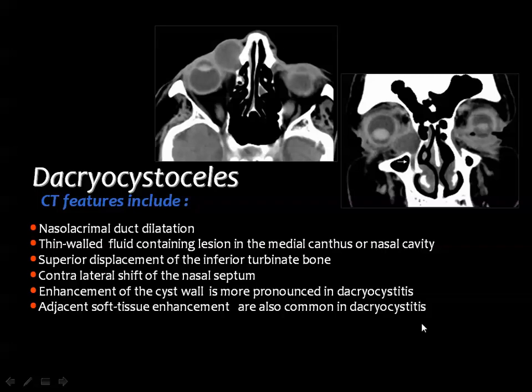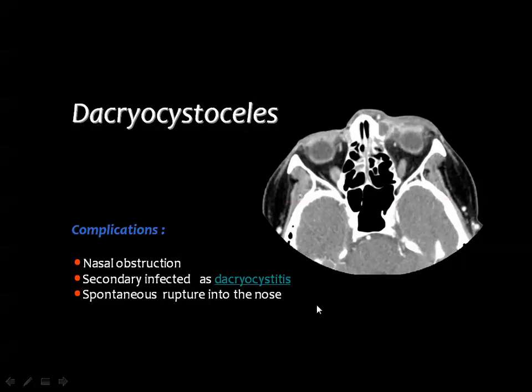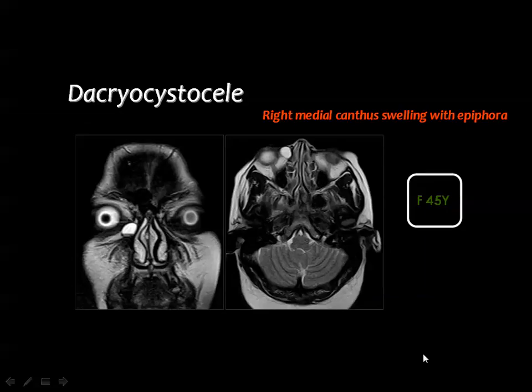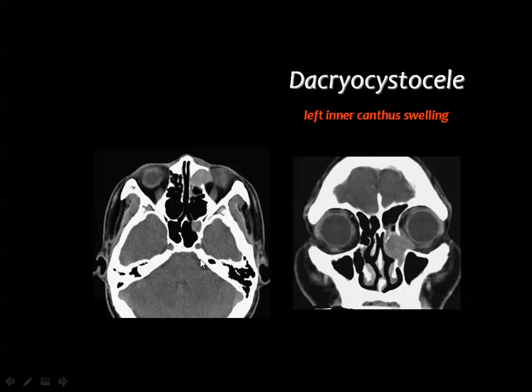If the dacryocele cystic lesion is infected, contrast injection produces marginal enhancement, indicating the presence of infection and abscess formation. Being a fluid-containing cystic lesion, the dacryocele appears as bright signal on T2-weighted MRI. Coronal T2 images also show bright signal of the dacryocele, corresponding to the anatomic site of the nasal lacrimal duct.